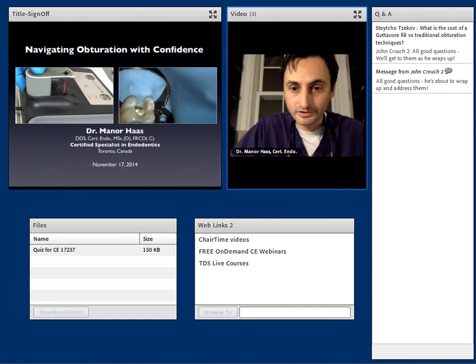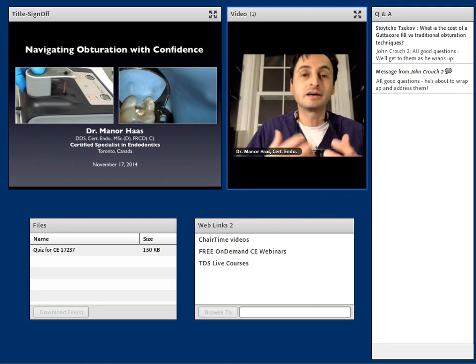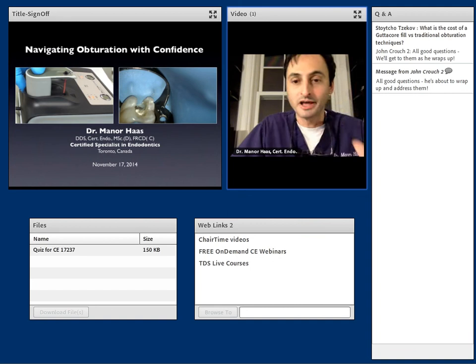Let me see another question over here. Oh, yeah, so Muhammad was asking, do the colors of the ProTaper Universal match the ProTaper Gold? Yep, this is 2014. Remember, I love it when things are simplified. Tulsa has done that. One of my two catches was, can you color match these things? So absolutely, whether you're using ProTaper Gold or Universal, those colors will match the corresponding GuttaCore. It's sweet and simple. You don't need complications in your life.